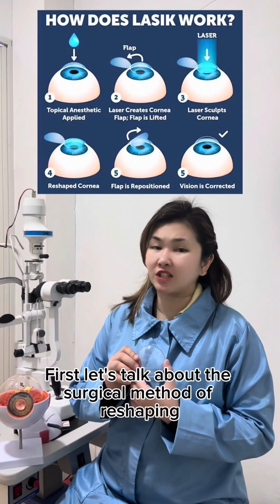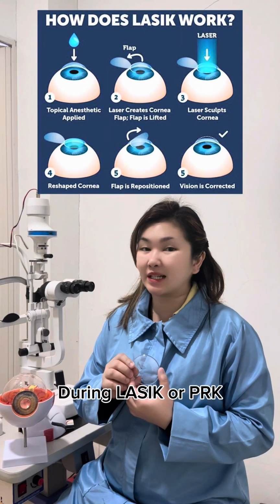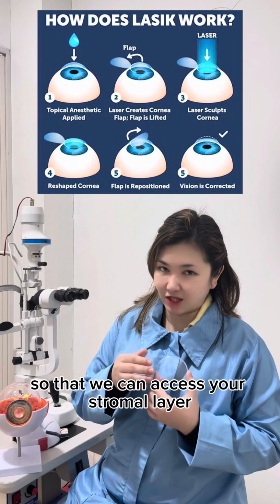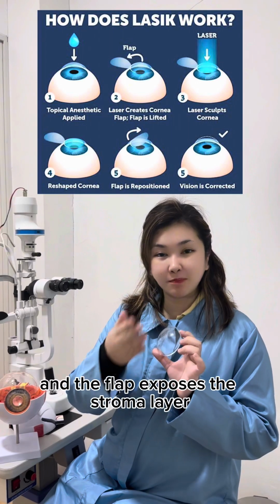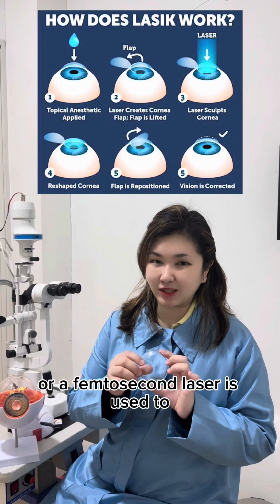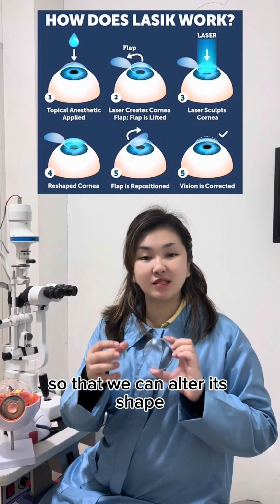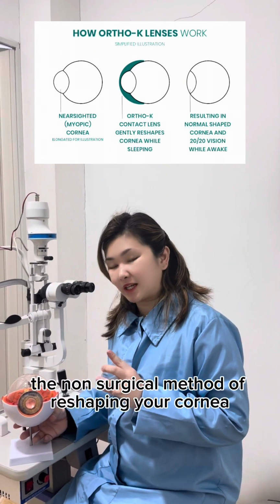First, let's talk about the surgical method of reshaping your cornea. During Lasik or PRK, we need to temporarily remove your epithelial layer so that we can access your stromal layer. A keratome blade is used to create a flap, and the flap exposes the stromal layer. An excimer or a femtosecond laser is used to permanently remove some tissue of your cornea so that we can alter its shape.